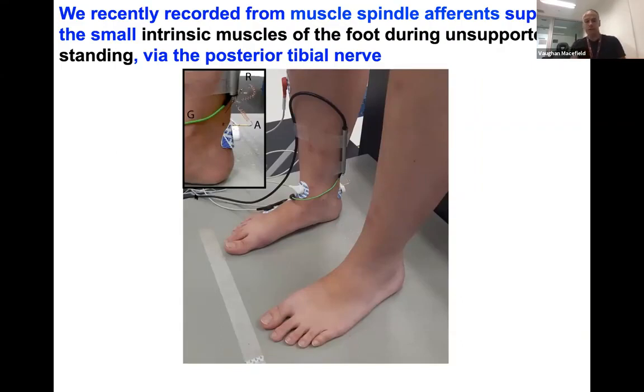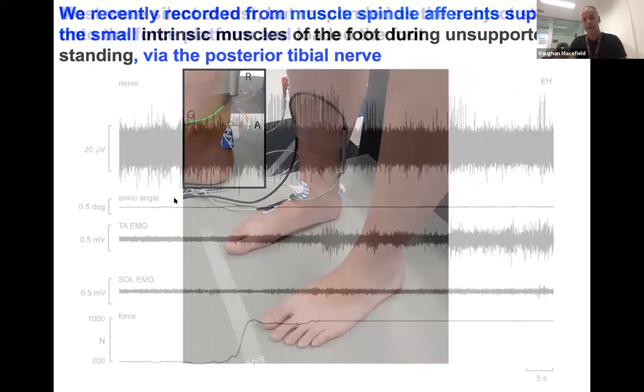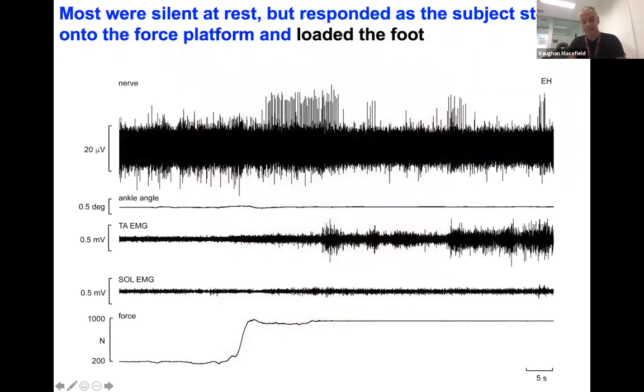The advantage of this approach is that when you stand up, there are very small changes in ankle angle if the leg is just supported, you know, seated and not resting on anything. But as soon as we stand, now this is the force from the force platform, this is the EMG from tibialis anterior and from the soleus muscles. You can see that a muscle spindle here, in one of the intrinsic muscles of the foot, responds to that force, the whole body weight being applied to the foot.